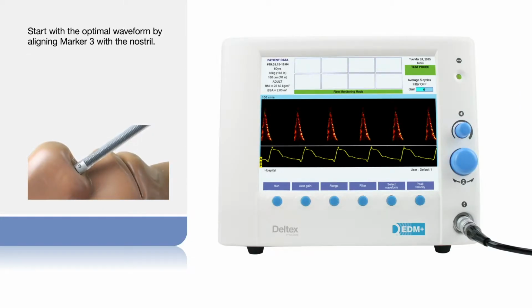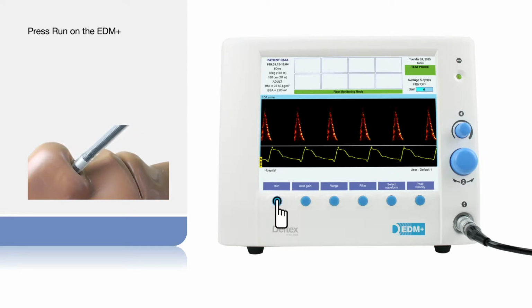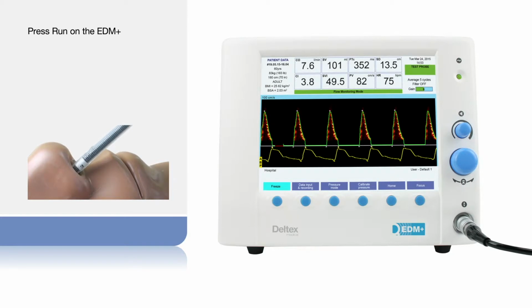Start with the optimal waveform by aligning marker 3 with the nostril. Press Run on the EDM+, and once the green line follower is in place, the flow parameters can be calculated.